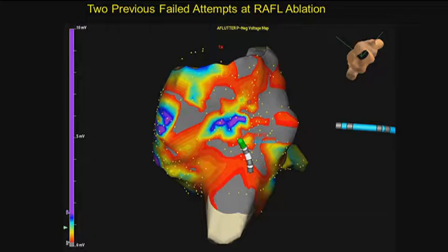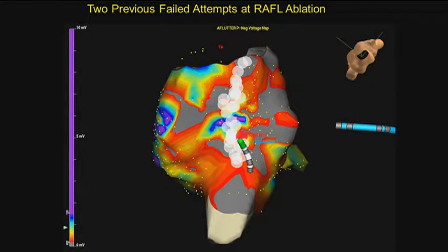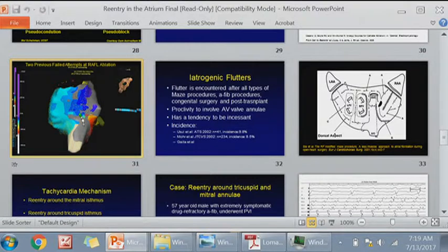And one of the new findings that we are seeing nowadays with arrhythmia cases is that even right atrial flutter actually has epicardial components of its circuit. So you're going to be seeing more of these kinds of tough cases where, in termination of flutter, sometimes this line didn't matter, and what mattered was just exactly the 4 areas from which you were able to record a potential. So it's worth keeping that point in mind.